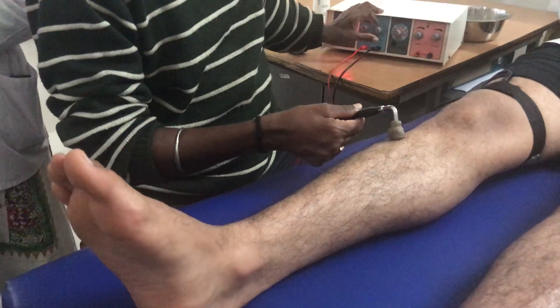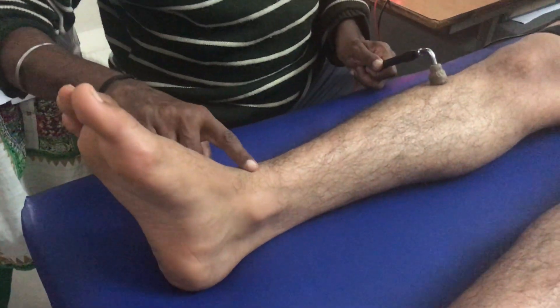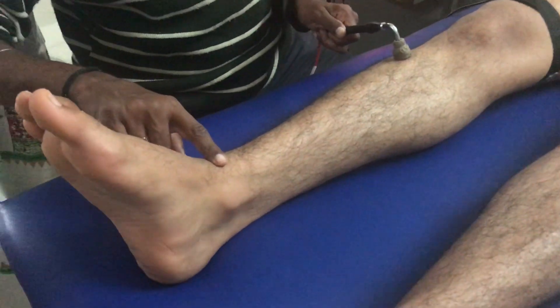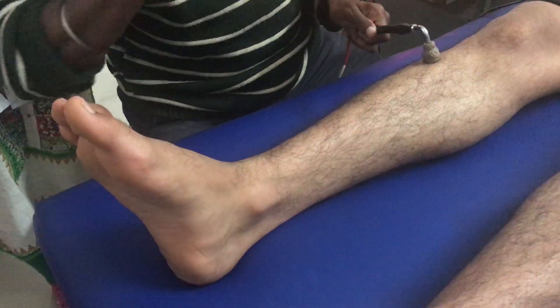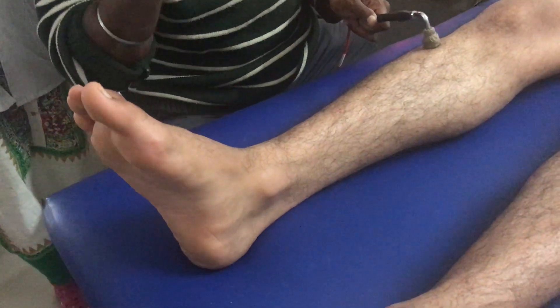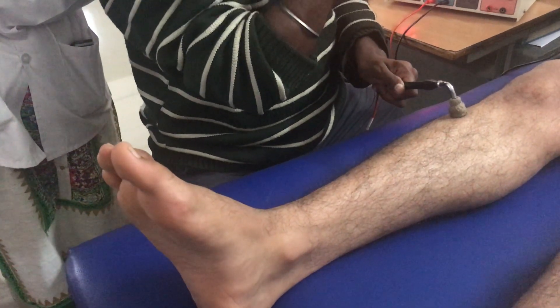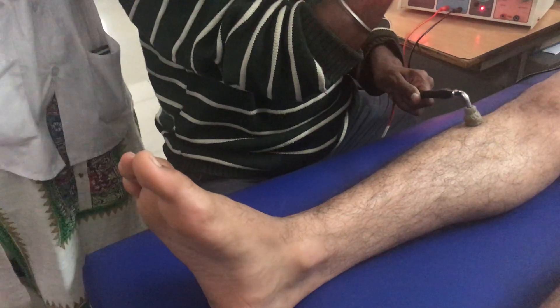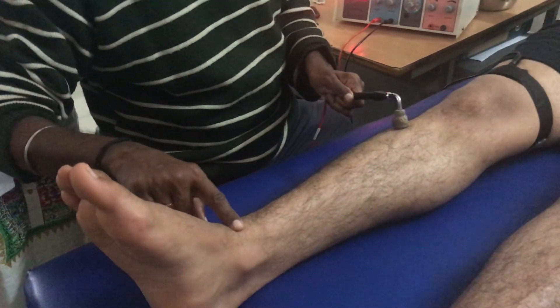Now going for the next duration, which is 3ms. The sensory perception has reduced, but I am talking about the strength of contraction. The reason the sensory perception is reduced is that I started with 300ms and have now come to 3ms — one hundredth of what I gave at first. That is why his sensory perception is less. I am still increasing the intensity to get the muscle contraction, yet he feels less current because the duration of flow has reduced considerably.